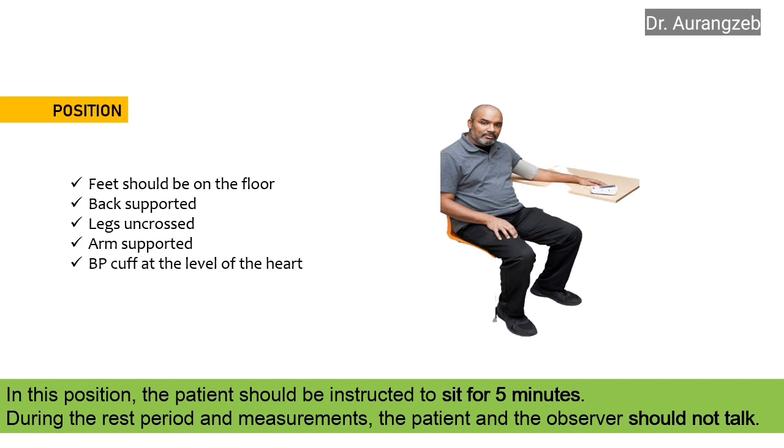During the rest period and measurements, the patient and the observer should not talk. This is the most important step. Both the observer and the patient should remain calm, and they should remain quiet while the rest period is being observed.